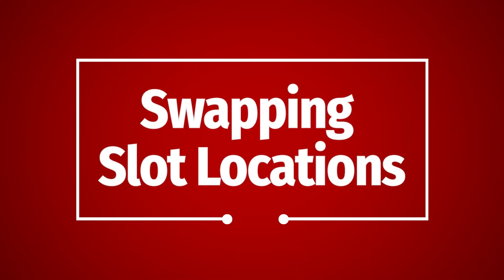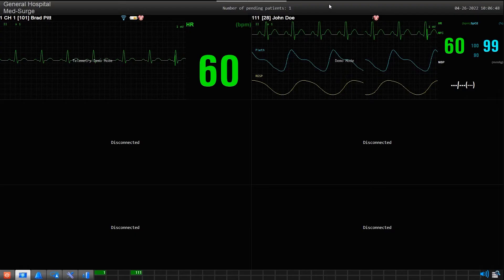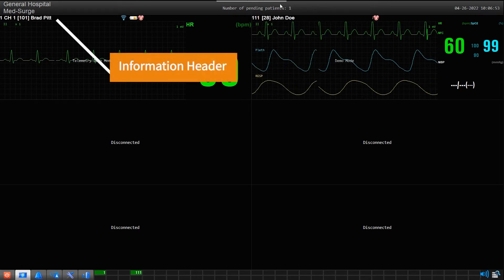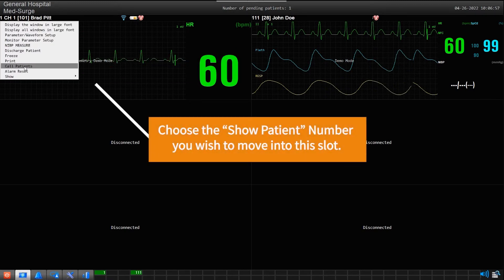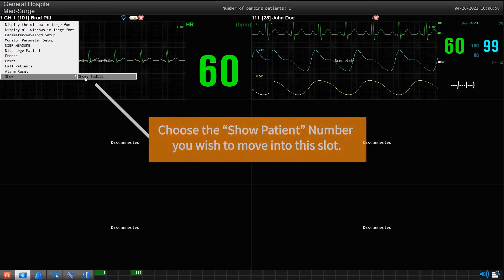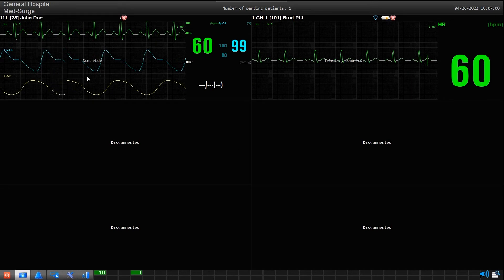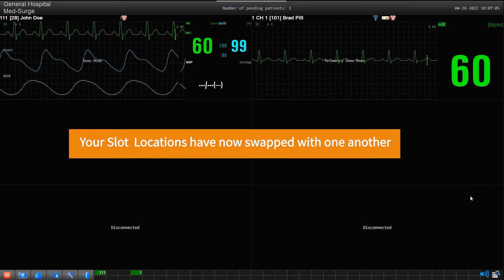Swapping Slot Locations: You can swap already active patient positions very easily on the MFM CMS central station. First click in the information header of the slot you wish to move the patient into, then just choose the show bed number from the slot you wish to swap with. You will see your selected bed swap into this new location.